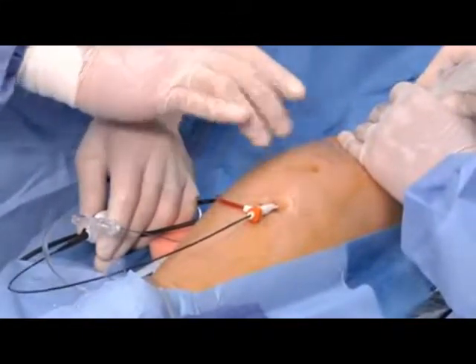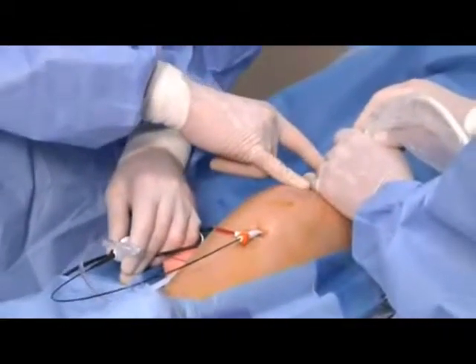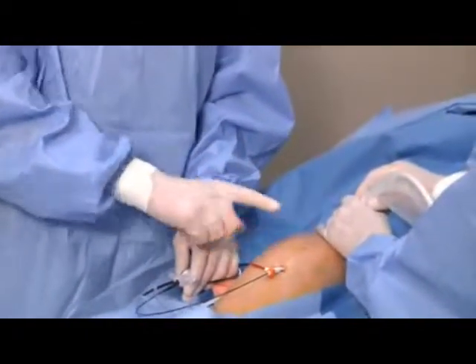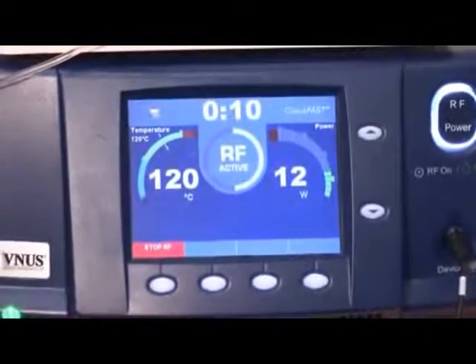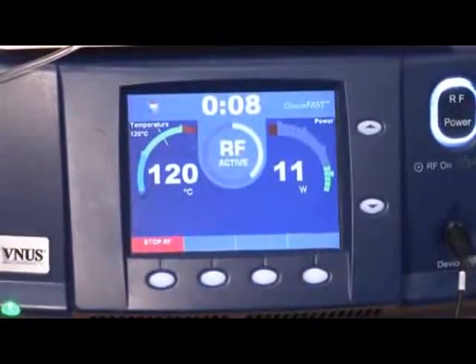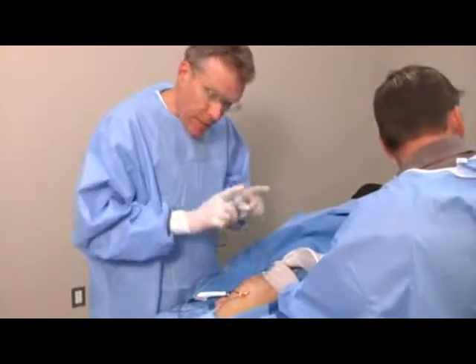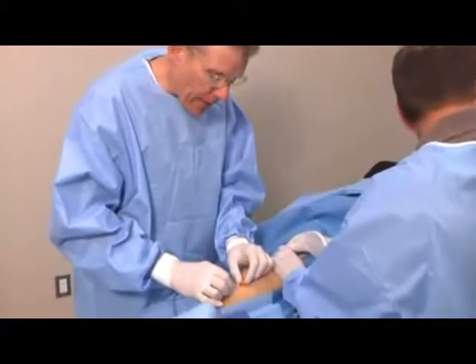And now in a stepwise fashion, we'll apply heat up to 120 degrees Celsius in three stages along the vein. As I apply the heat, we'll look at the radiofrequency generator — 11, 10, 9 — for a total of 20 seconds. Next, we'll withdraw the catheter in several steps. So I'm bringing the catheter back as we speak.